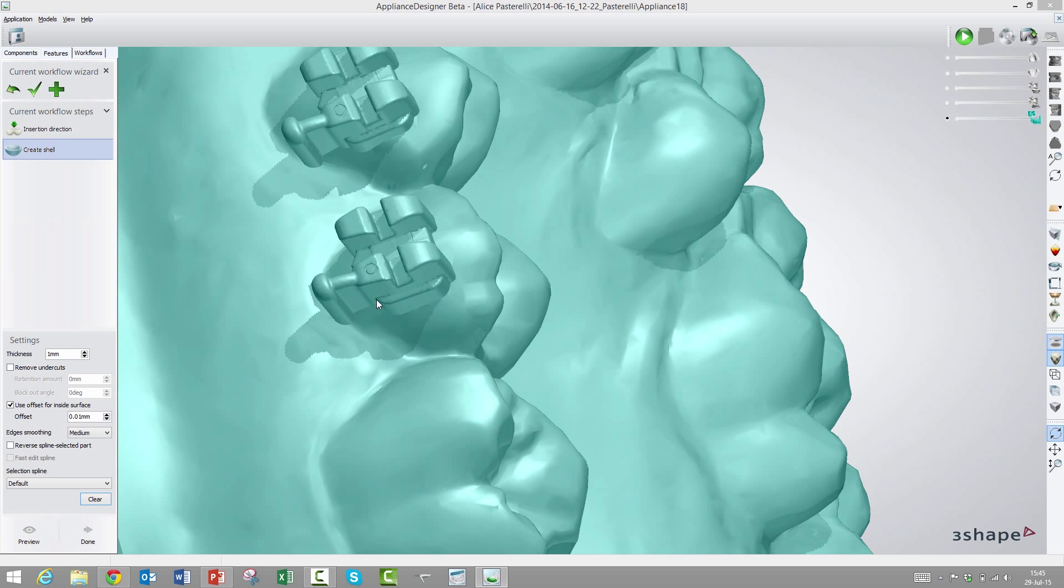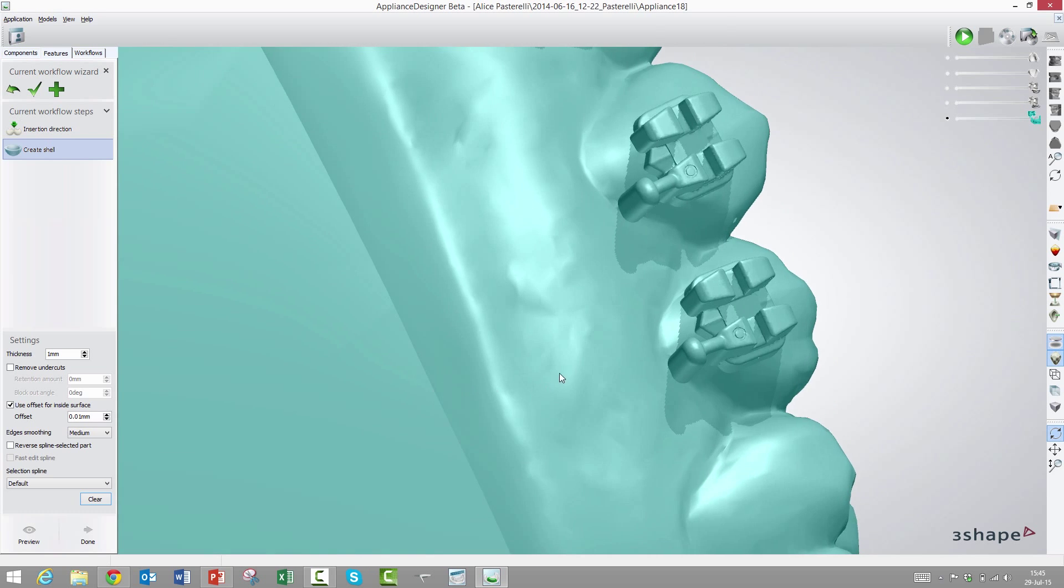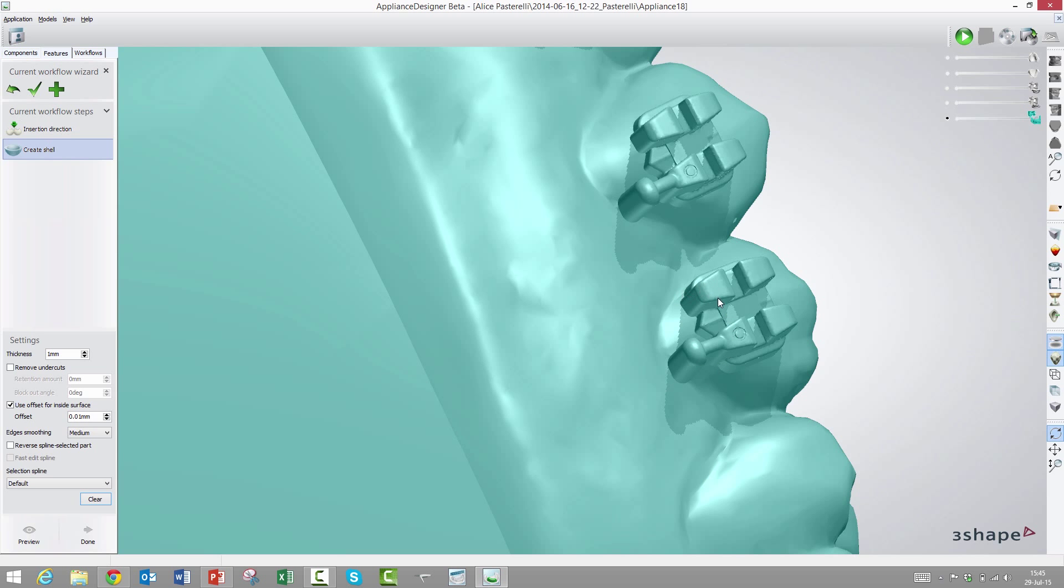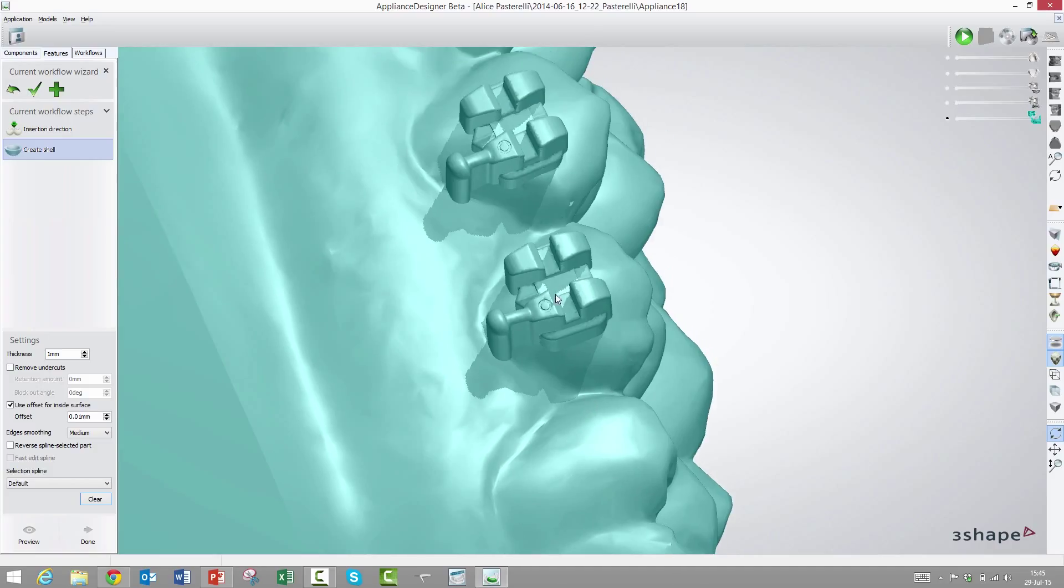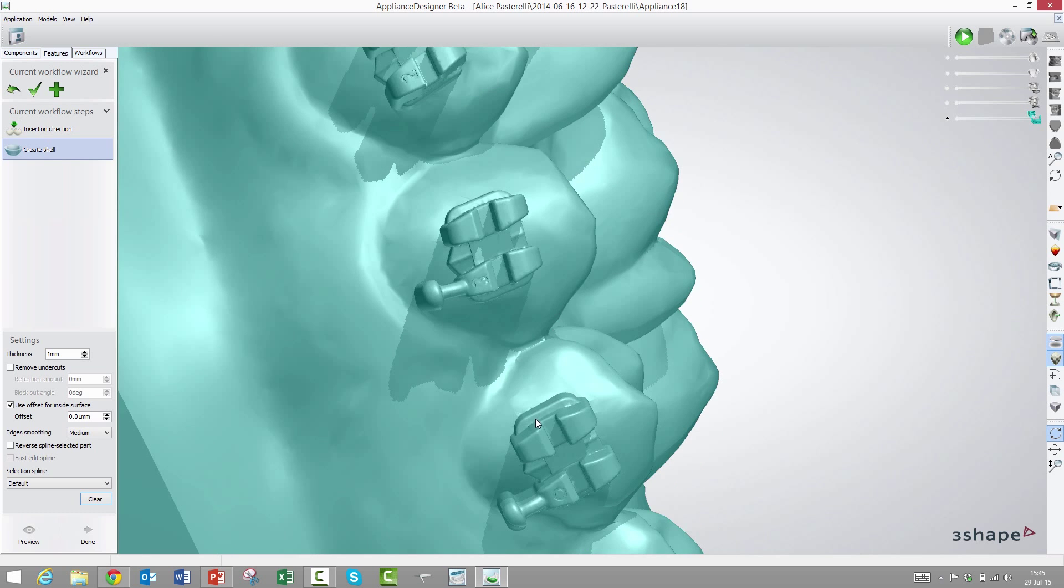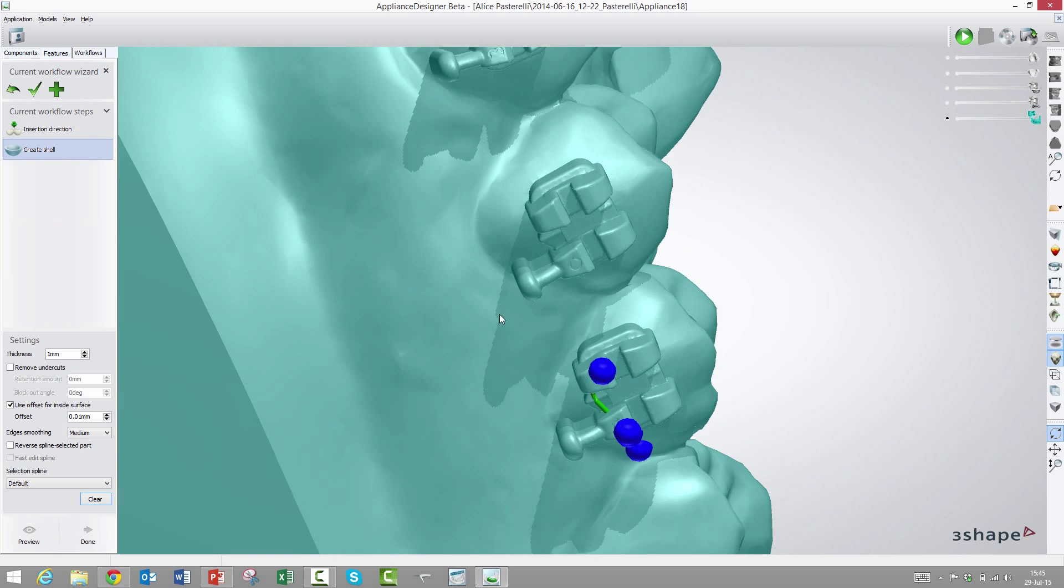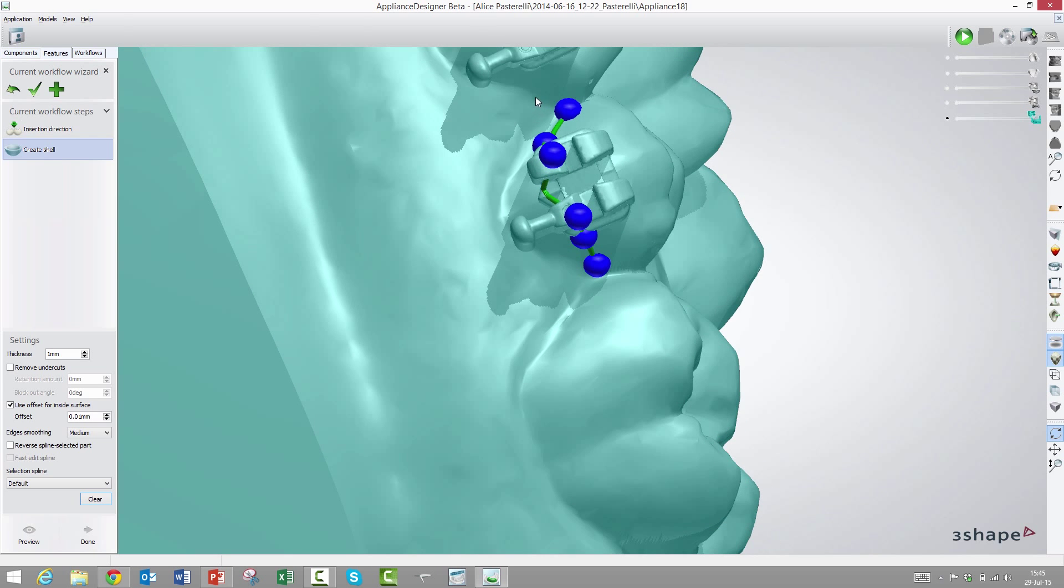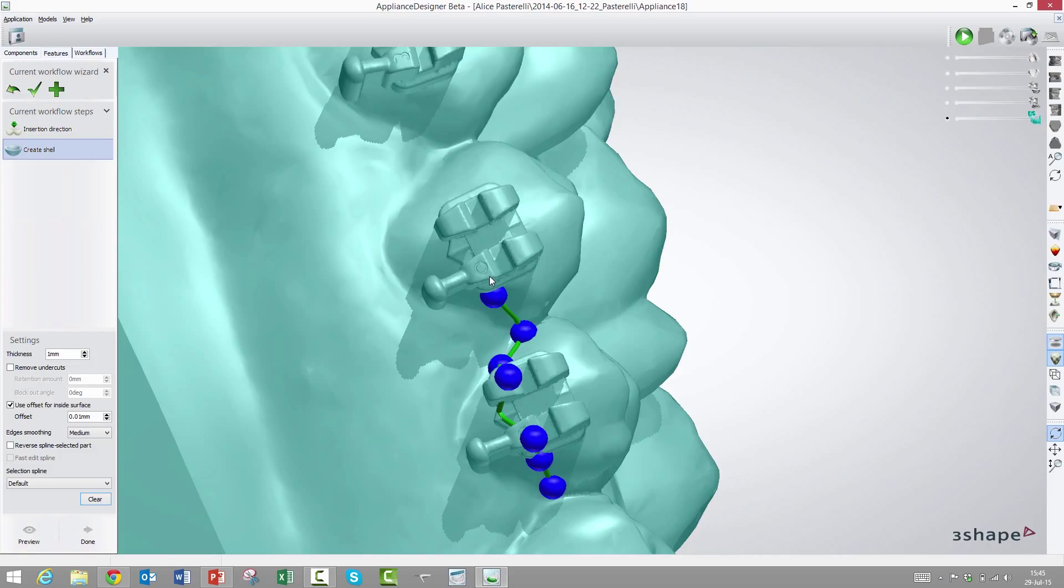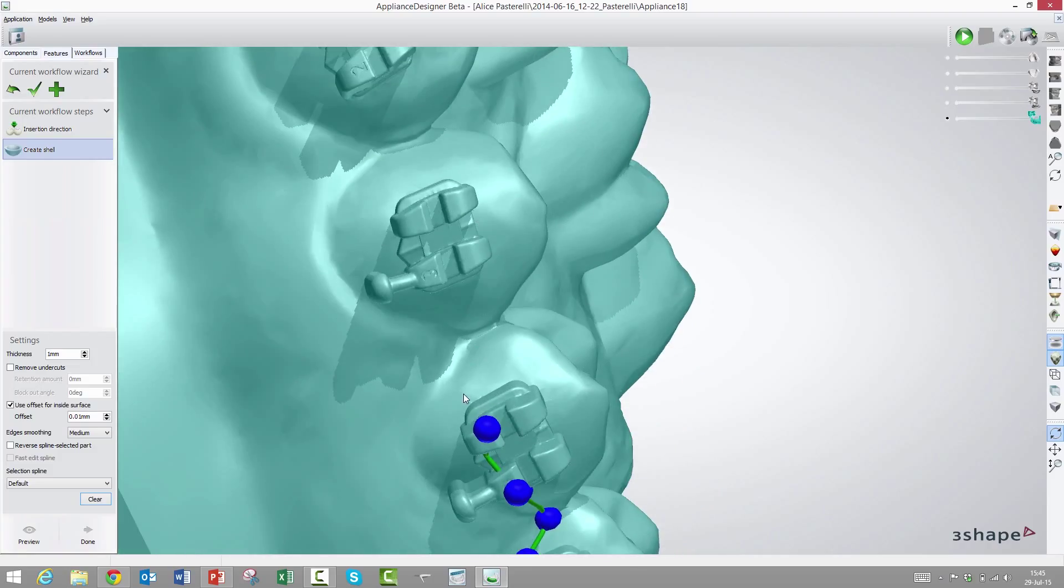With the insert direction properly set, we need to trace where we want the transfer tray to go. We would like the transfer tray to grip around as much as possible of the brackets but at the same time allow it to escape once we remove the transfer tray from the patient. If we have an open space here towards the gingival edge of the transfer tray, the bracket will be able to escape once we pull out the transfer tray in the direction of the insert direction.